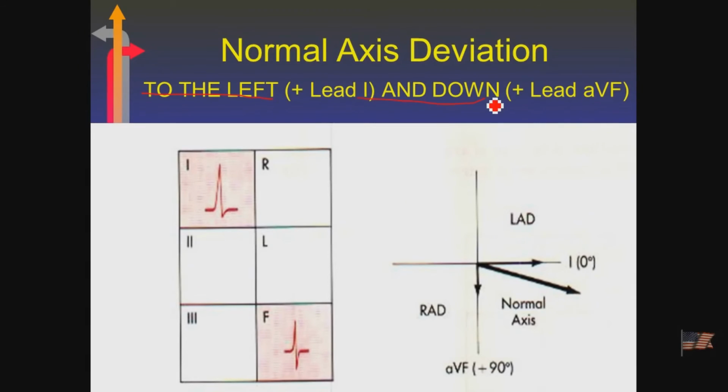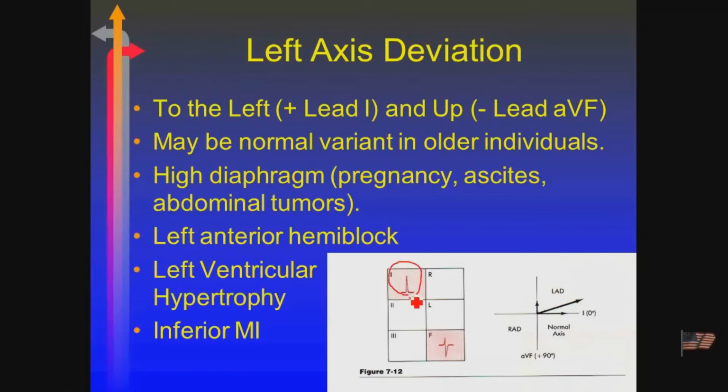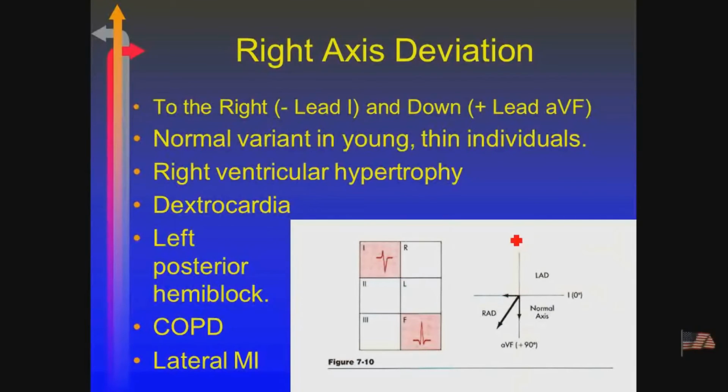So again, to the left and down, both positive, normal axis. To the left and up would be left axis. And again, that's where we might see some anatomical things going on, where the diaphragm is pushing and the heart is being kicked up towards the left. Left ventricular hypertrophy, or an inferior MI will yield the same exact picture. We didn't really talk about bundle branch blocks, but if I have a left anterior hemiblock, you'll get that kind of picture also. But we'll let that one go for now.